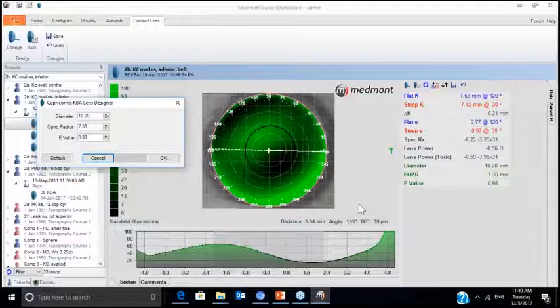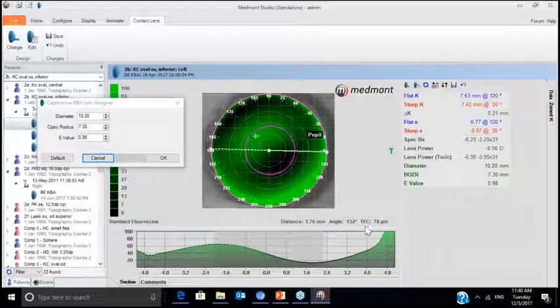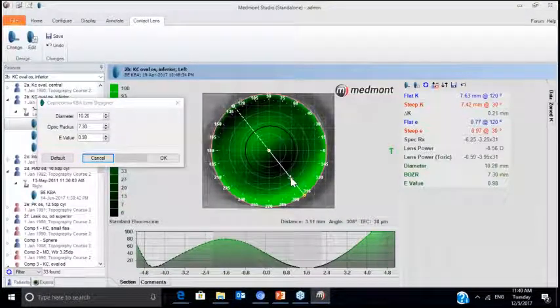So within a few seconds, we can try on different base curves to determine, is there any hope of a corneal GP working on this patient? Clearly, we need to go so steep in order to clear over top of the diseased tissue that we create excessive vault over the center and just north of center, that we're likely to fail in vision and fail because we're going to get a bubble.